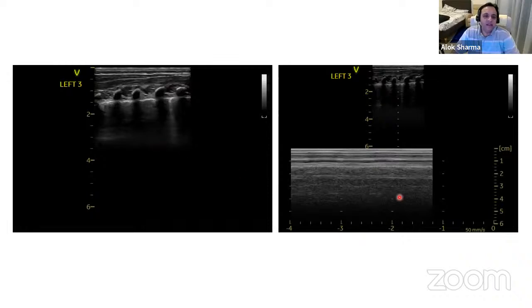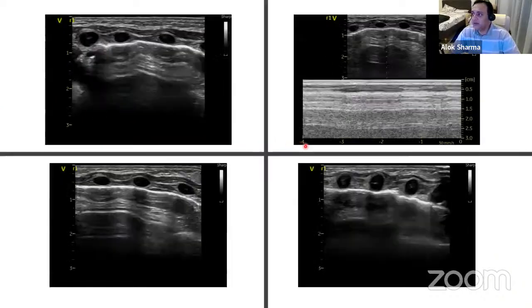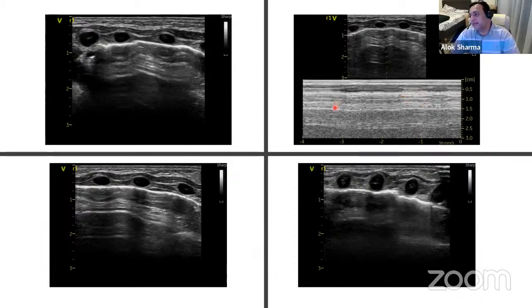So again, this is just L3. Can you see a classical seashore? Now, this is where I'd like to differentiate the previous slide from this slide. Can you see absolutely no barcodes? Is everybody happy there are absolutely no barcodes over here? Yes. Okay. Now we're going to just go back to the previous one. Can you see how there's a difference over here? This is not a clear-cut seashore. You have barcodes as well.